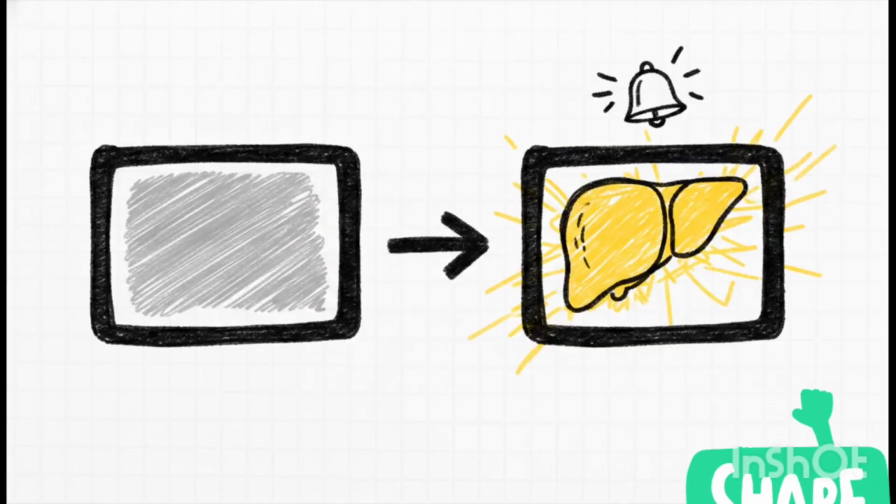So, what's the very first visual deviation from the baseline we just established? Well, the primary shift is brightness. Remember that nice medium gray echogenicity we just talked about? When fat accumulates in the liver cells, it actually creates way more interfaces for your ultrasound waves to bounce off of. Because more sound waves are reflecting back to the probe, that medium gray canvas turns intensely bright and really reflective on your monitor. When you see that overall brightness jump up like that, your internal alarm bells for fatty liver should absolutely start ringing.